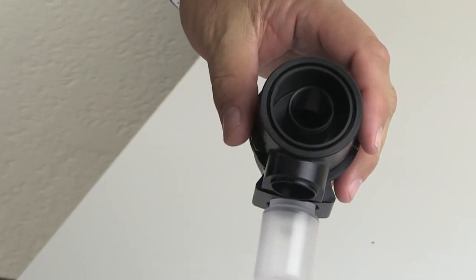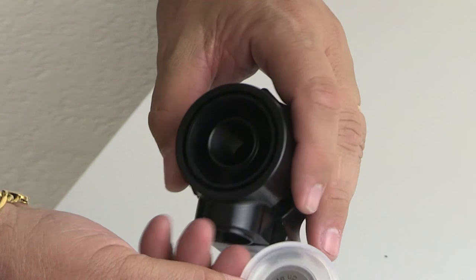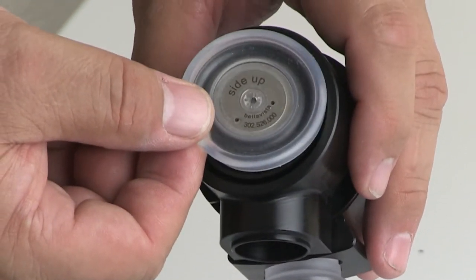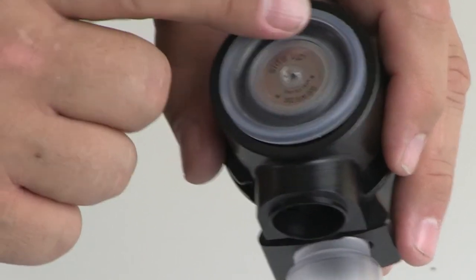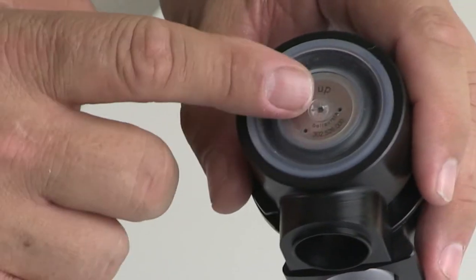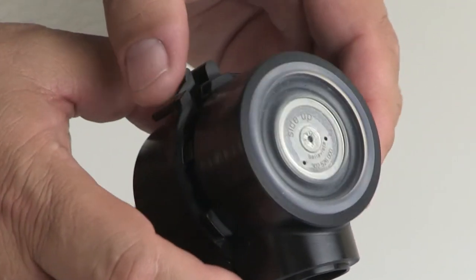Last but not least, I will assemble the diaphragm. You see the side up label on there? The side up label corresponds to the side up that I'm looking at now. So this has a bezel that you just fit into the valve, and now your valve is ready for assembly again.